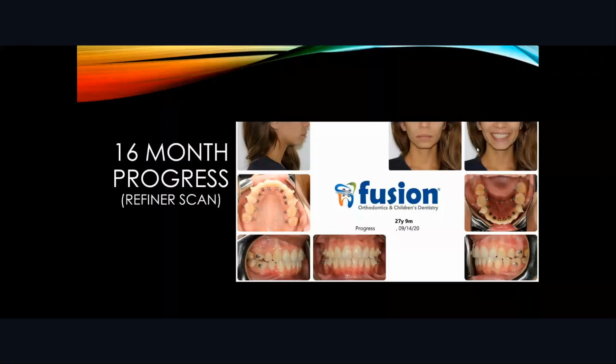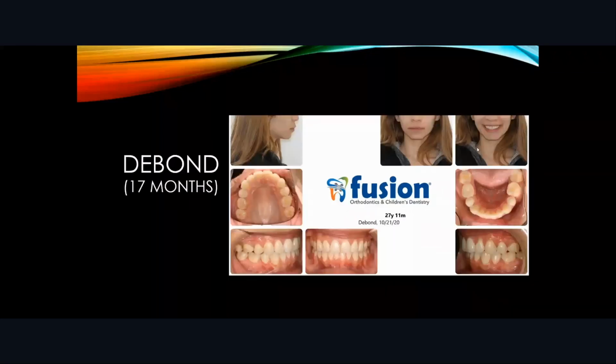But what I want to show you is that in a span of from September of 2020 to October of 2020, about 4 or 5 weeks, technically 4 or 5 aligners, I was able to settle that molar by a series of aligners. And how does that happen? One thing I have found out is that we don't have any bone loss. We don't have any root resorption. Everything looks fine. There's no white spots. But the teeth at the end of the treatment respond better to any kind of movement. They're more malleable per se.